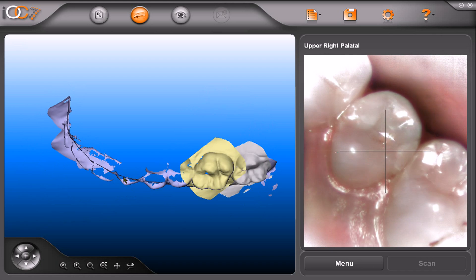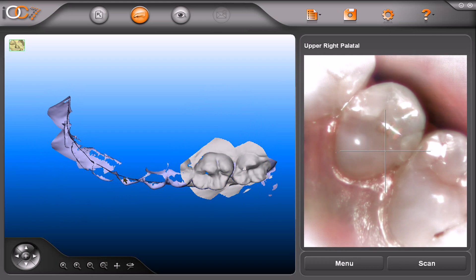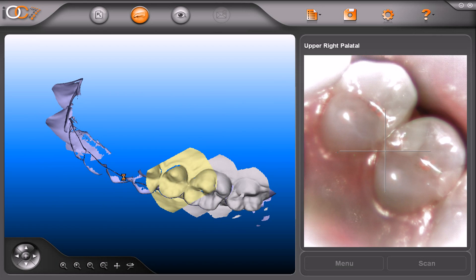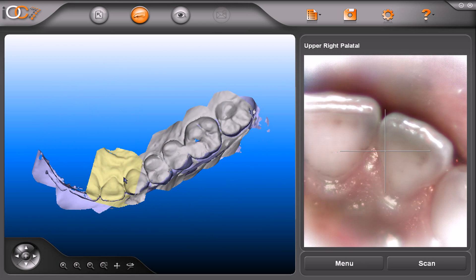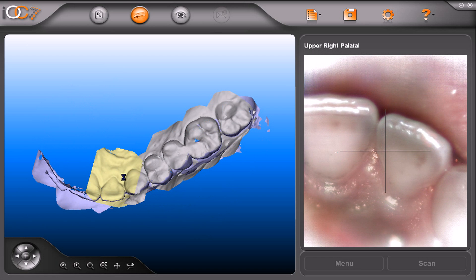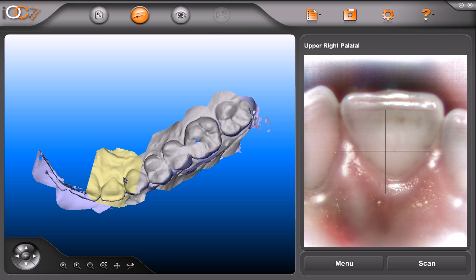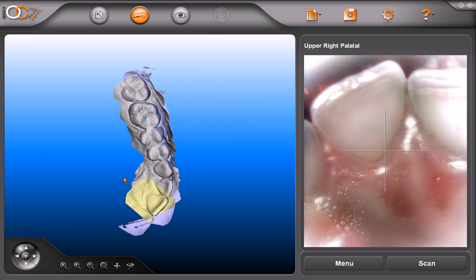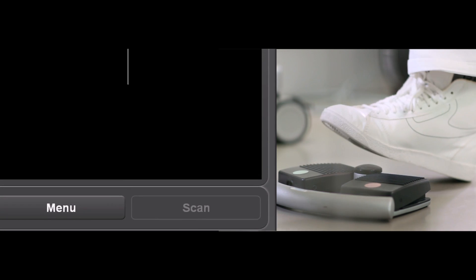Unlike the lower, when getting to the anterior of the upper, do not change the orientation of the scanner and keep a vertical orientation. In the viewfinder, it may not be perfectly focused. This is normal, as it is purely for positioning purposes. After finishing, press the pedal to continue with the next segment and take the upper left buccal scans.